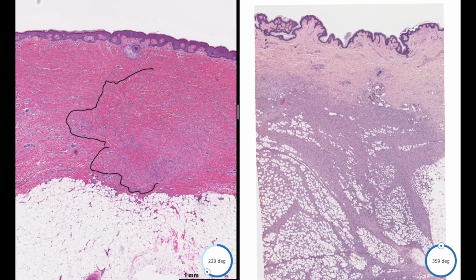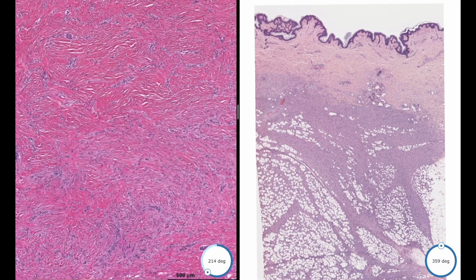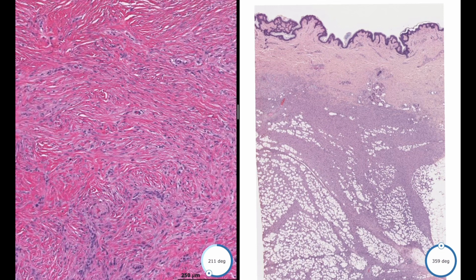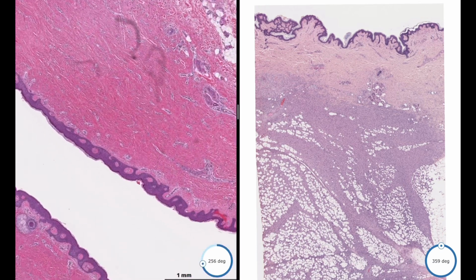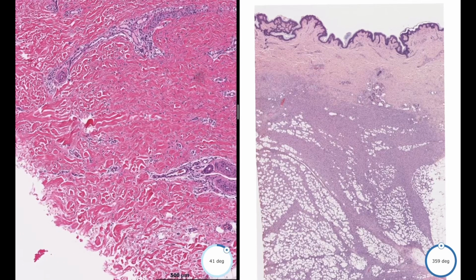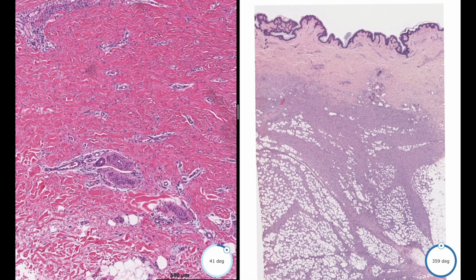The cellular population of dermatofibroma is usually polymorphous, with round to spindle neoplastic cells with surrounding reactive macrophages, and there is characteristic collagen trapping at the periphery of the lesion, as you can see it right here. For example, in these areas, you can see the collagen entrapment.